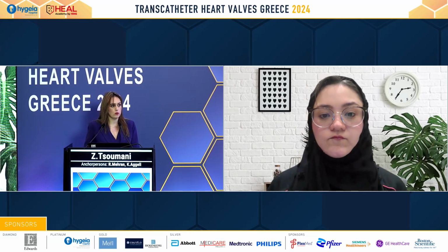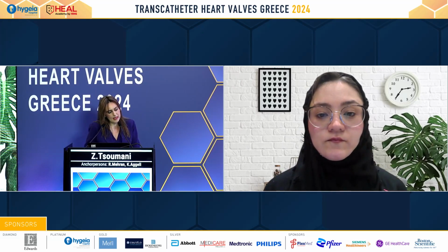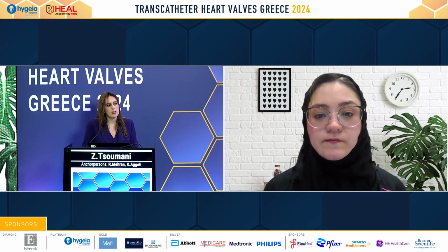The CT is ECG gated, right? Yes. So if the patient has atrial fibrillation? Yes, with the advanced technology, with the newest scanners, it's not any issue. The most important thing is to have as high temporal resolution as possible. So beta blockers may be the key to that, to have as close as 60 beats per minute. But with the advanced dual source or volume scanner, this should not be an issue.